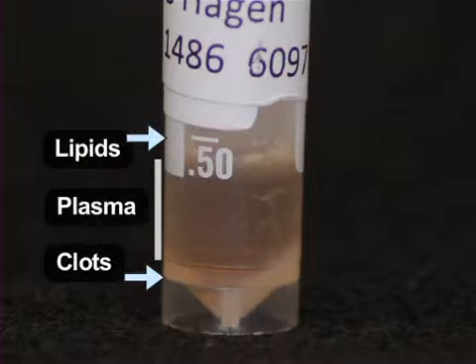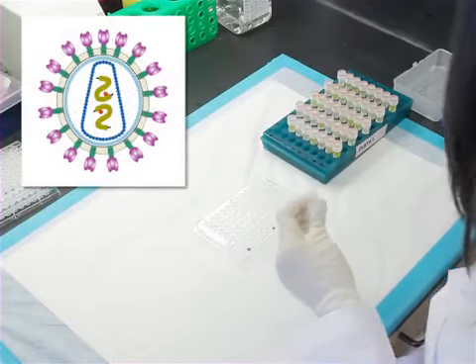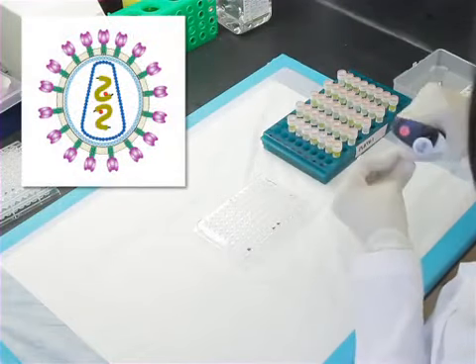Patient plasma samples are typically run in a competitive ELISA in order to determine if antibodies for certain pathogens, like the HIV virus, are present in the sample.